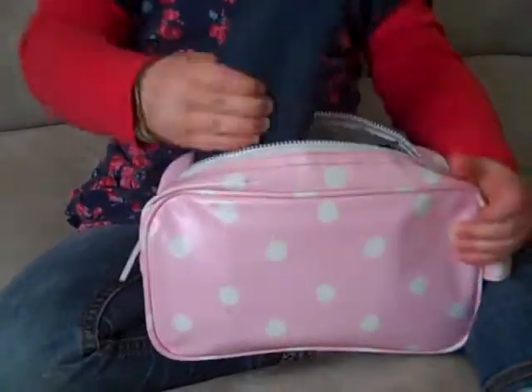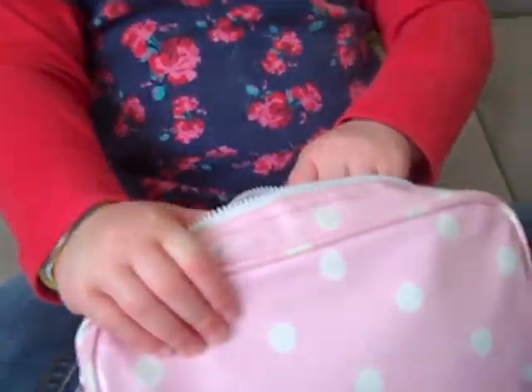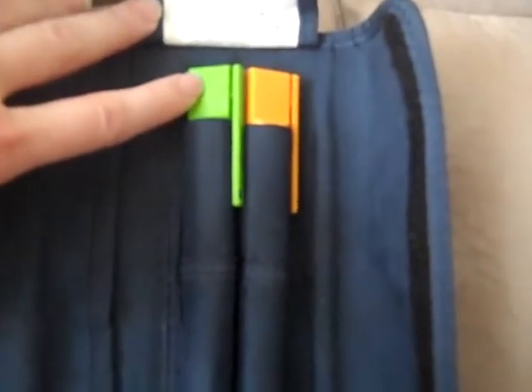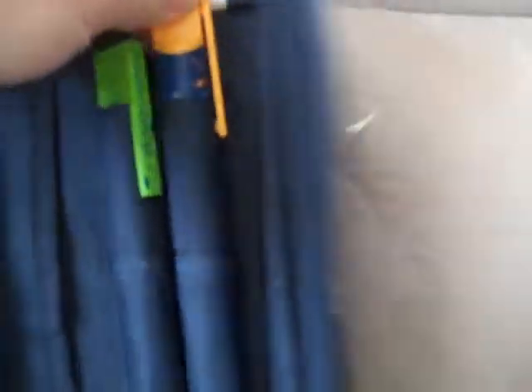This is Hannah's insulin pouch and she has two insulin pens in there. The green one is her Levemir, which is her long-lasting insulin that she has in the morning with breakfast. This one is her Novorapid, which she has with her meals. The lid comes off and there is a cartridge of insulin in there. In this pouch we keep the needles for the day.